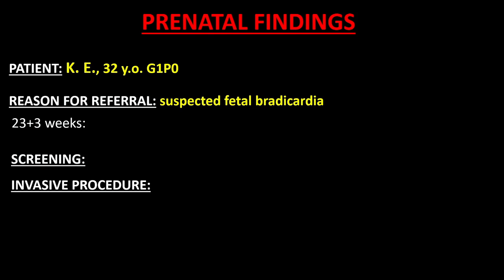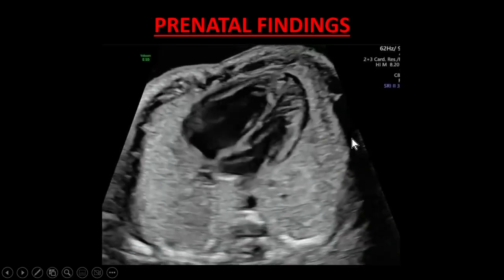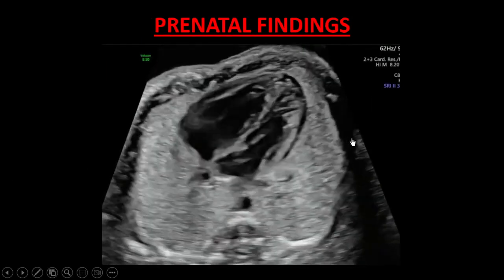And this is a patient that was referred for fetal echocardiogram at 23 weeks and 3 days. That was her first pregnancy, no complicating factors. She declined all the screening. And so the suspicion was for bradycardia on her morphological assessment in the mid-second trimester by her doctor. The fetus was in breech presentation.